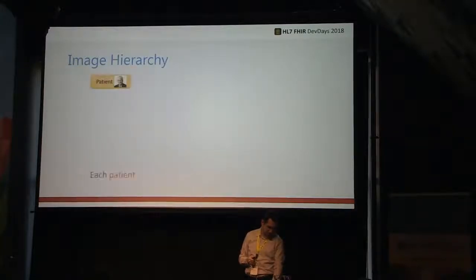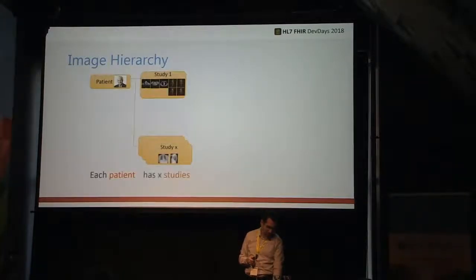All right. Now, hierarchy is important to understand. So we start with the patient. Patient has a number of studies. Okay, so a study is when, let's say, for example, they want to check if you have cancer. Okay, so a study is created.